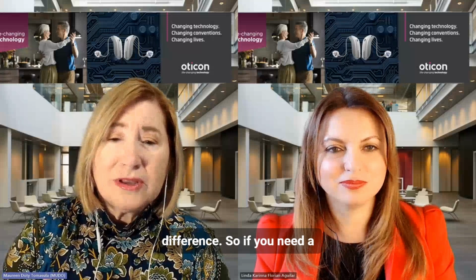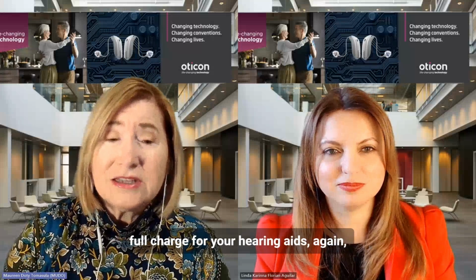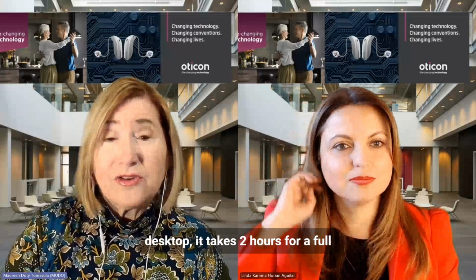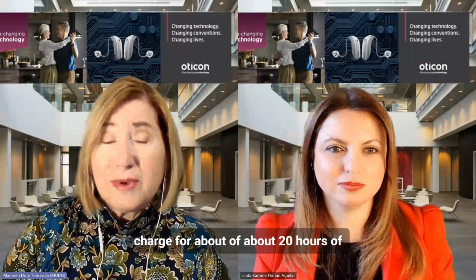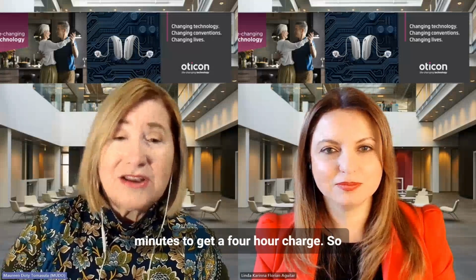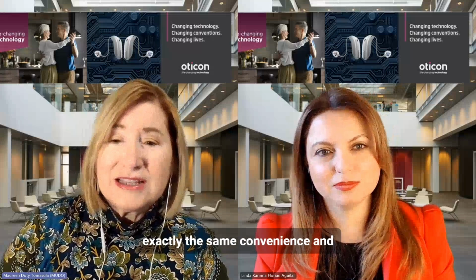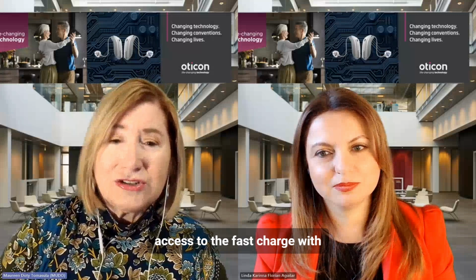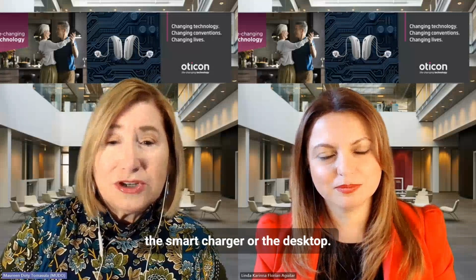So if you need a full charge for your hearing aids, whether it's the smart charger or the desktop, it takes 2 hours for a full charge for about 20 hours of use, including streaming, and only 15 minutes to get a 4-hour charge. So exactly the same convenience and access to the fast charge with the smart charger or the desktop.